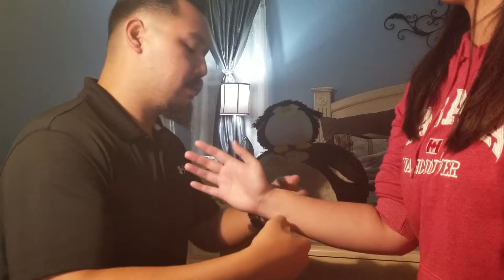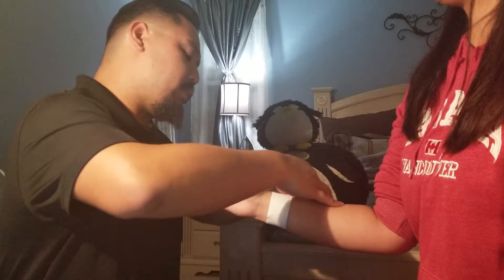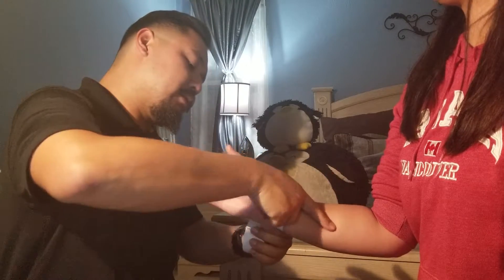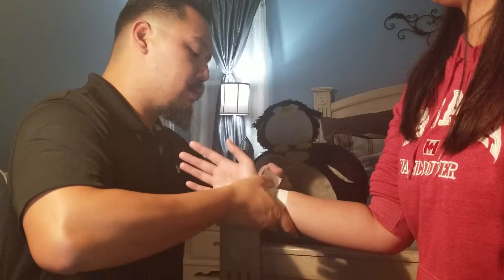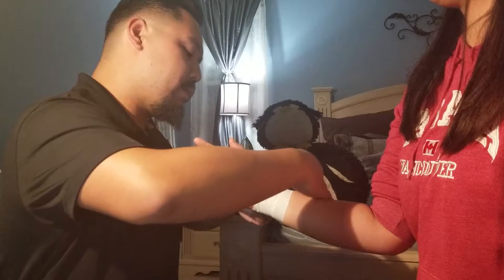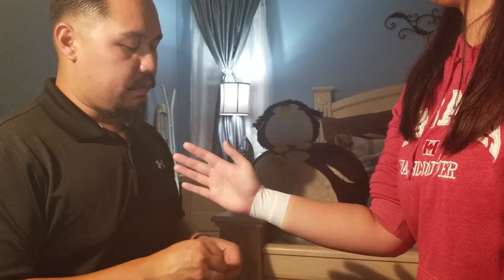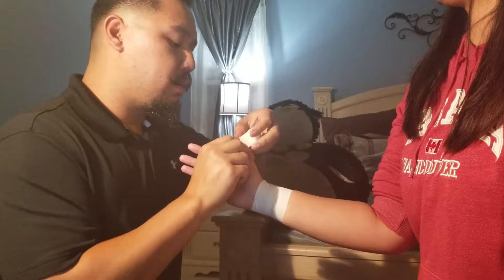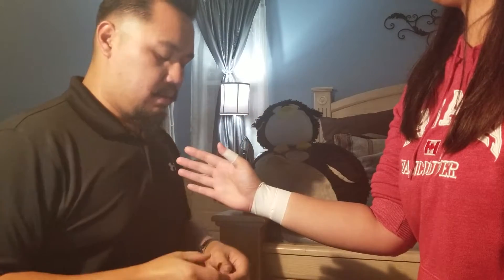We're going to start by placing two anchors along the wrist. It's important that we keep the wrist in a neutral position and the thumb also in a neutral position. Two anchors around the wrist and one anchor around the distal interphalangeal joint.